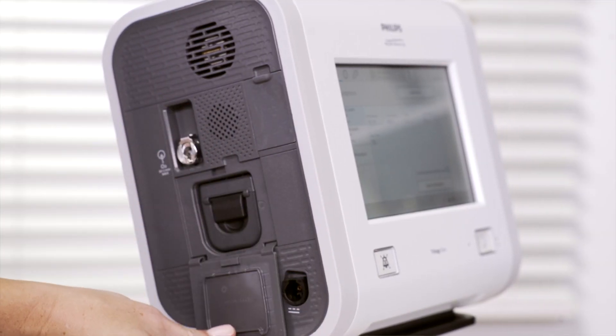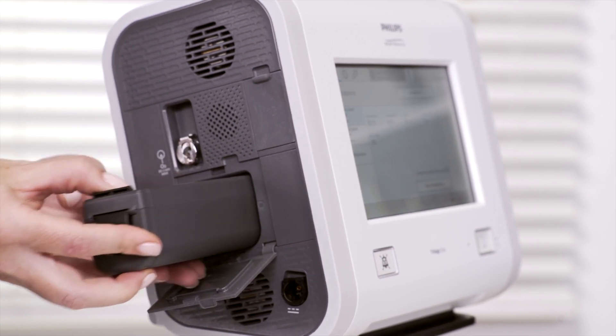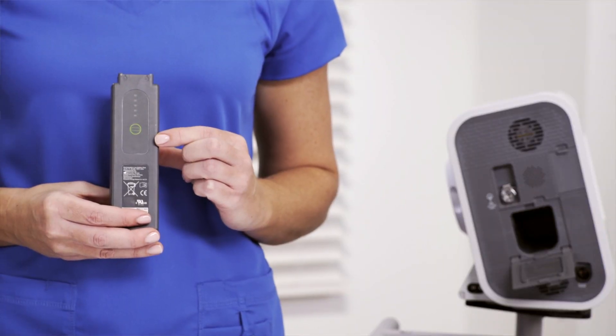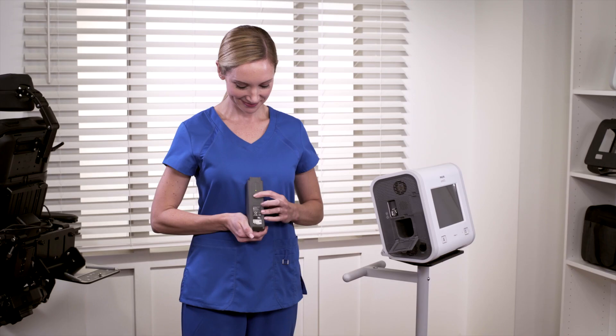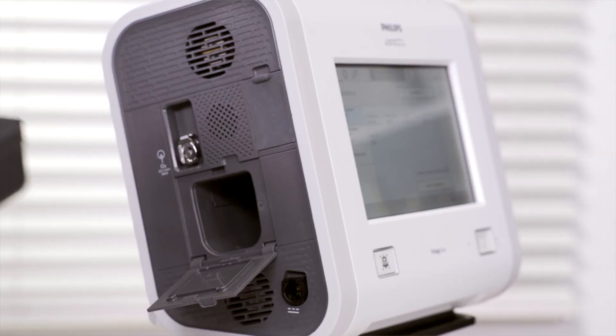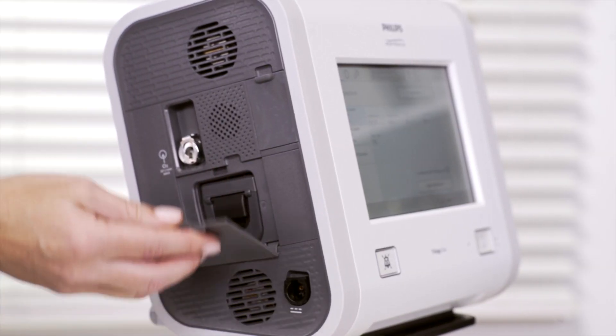To remove the detachable battery, open the access door, then lift the battery handle and gently pull it out of the battery bay. To view the percentage charge, press the button on the battery. To replace the battery, slide it into the bay until it clicks into place. The battery will charge automatically when connected to AC power.